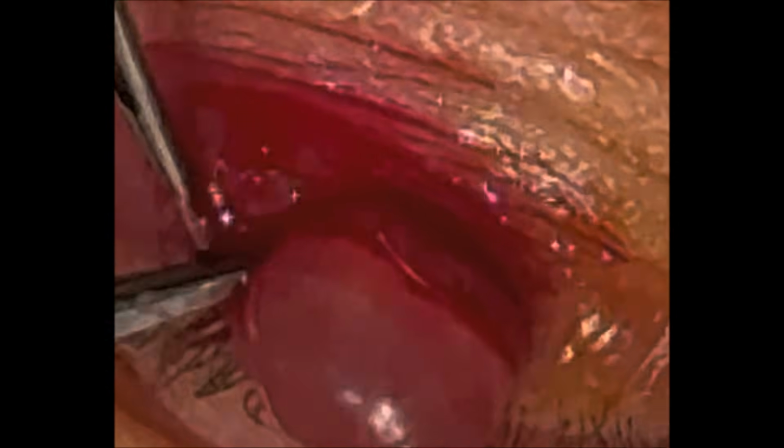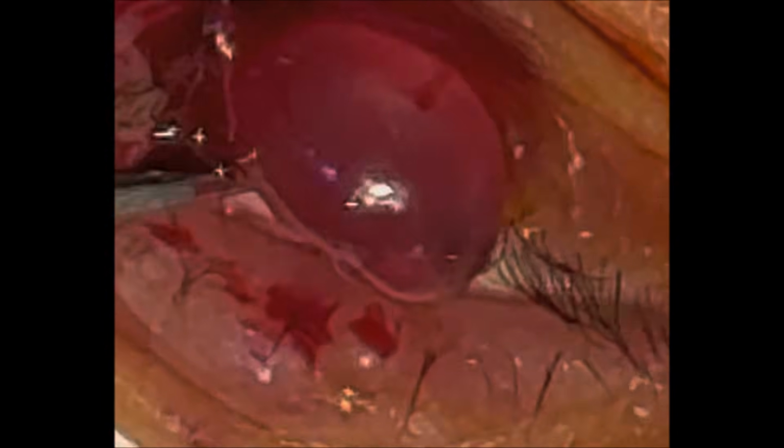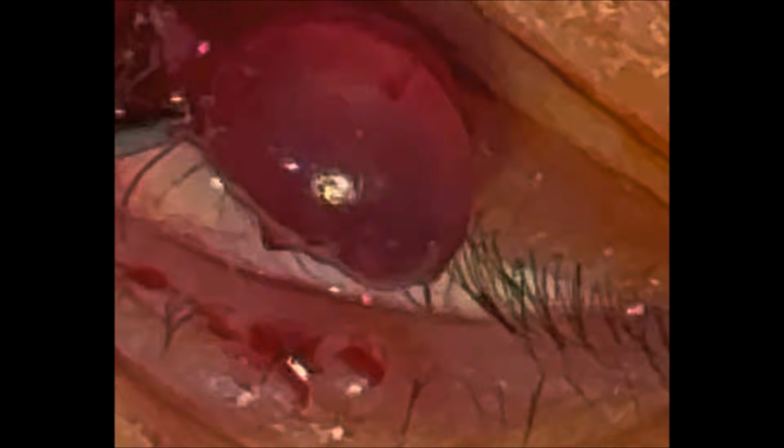Fortunately, in this case, so far, I'm able to maintain the cyst and the fluid inside it. I'm going to try to amputate the cyst now at the base. I got most of it uncovered. The skin is no longer covering the cyst. I'm just bluntly trying to push it away. But at some point, you do have to just amputate it.